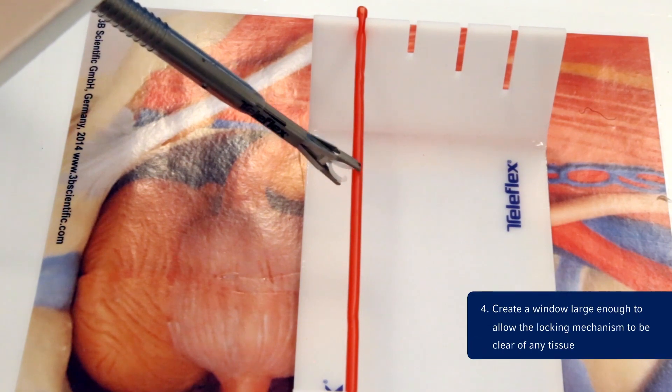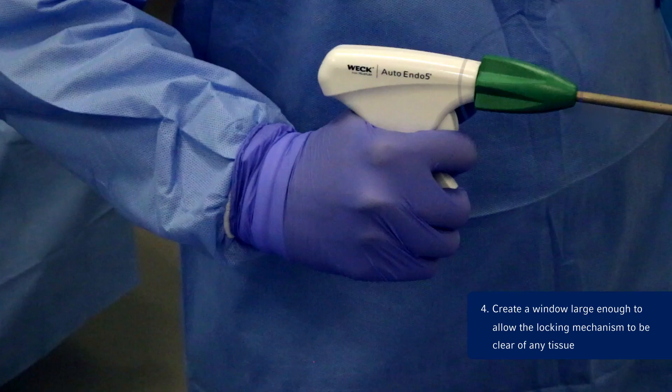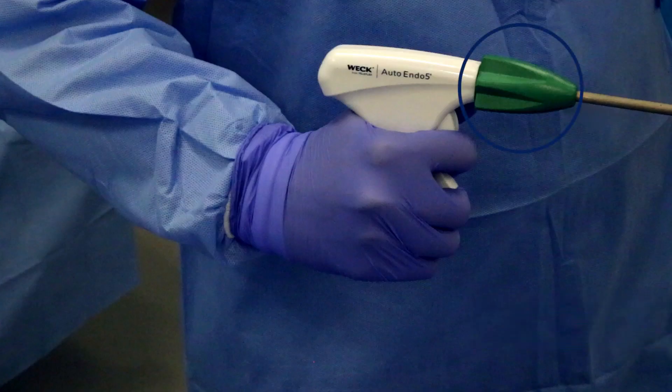Step 4: Prior to positioning the clip on the desired structure, create a window large enough to allow the locking mechanism of the clip to be clear of any tissue. The rotation knob is ergonomically designed for one-handed 360-degree rotation, which aids in approximating the clip over the vessel.